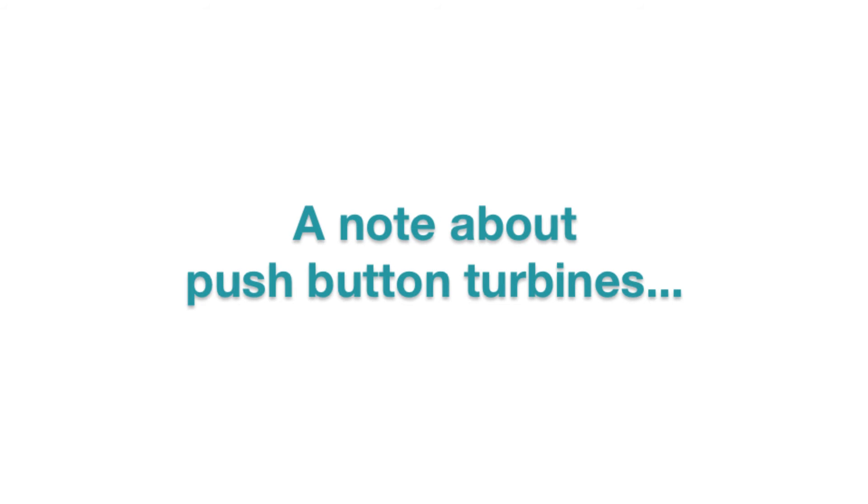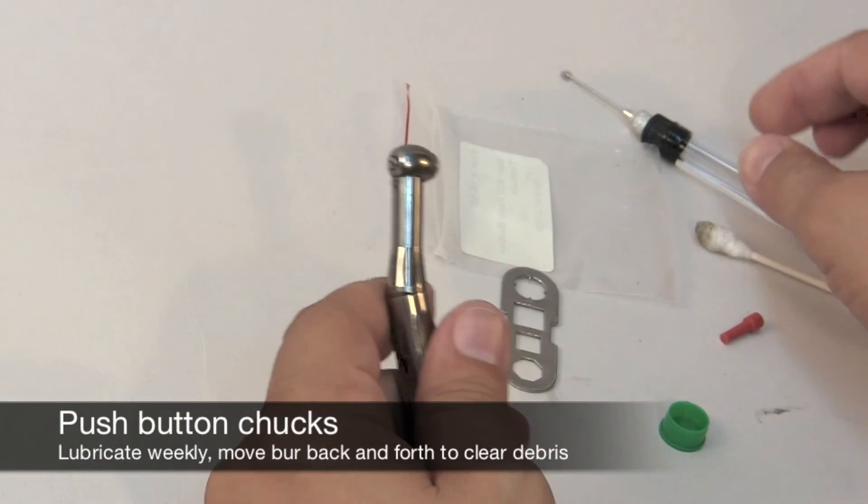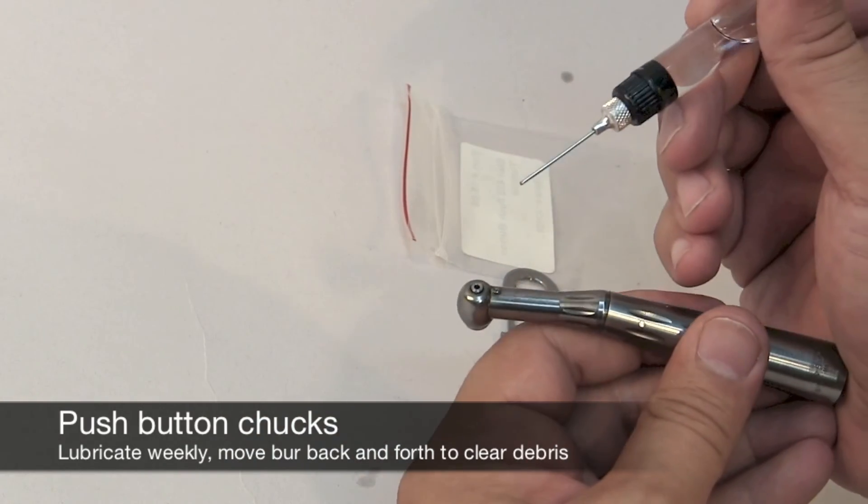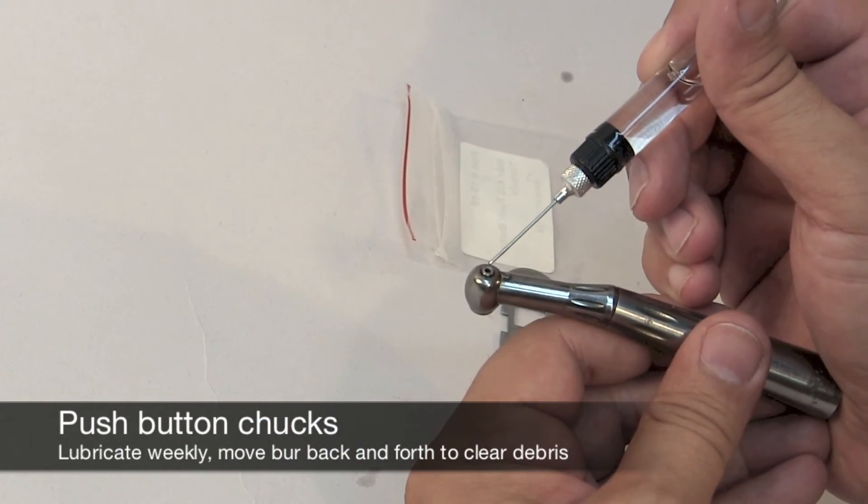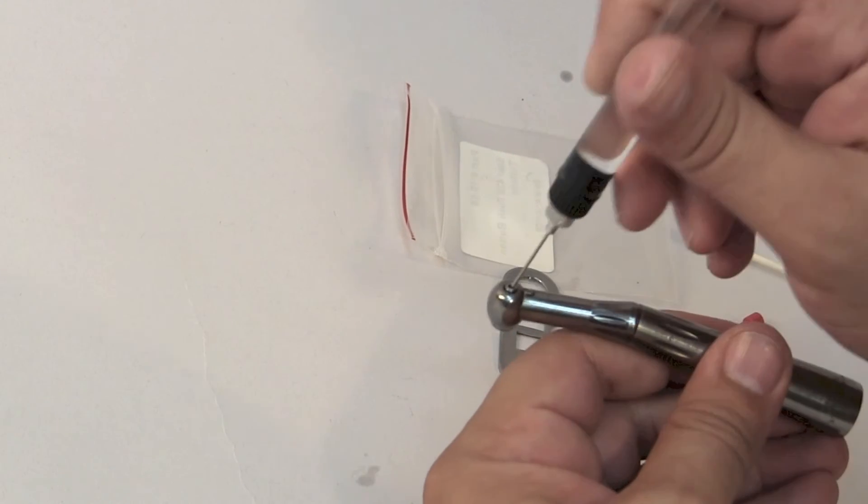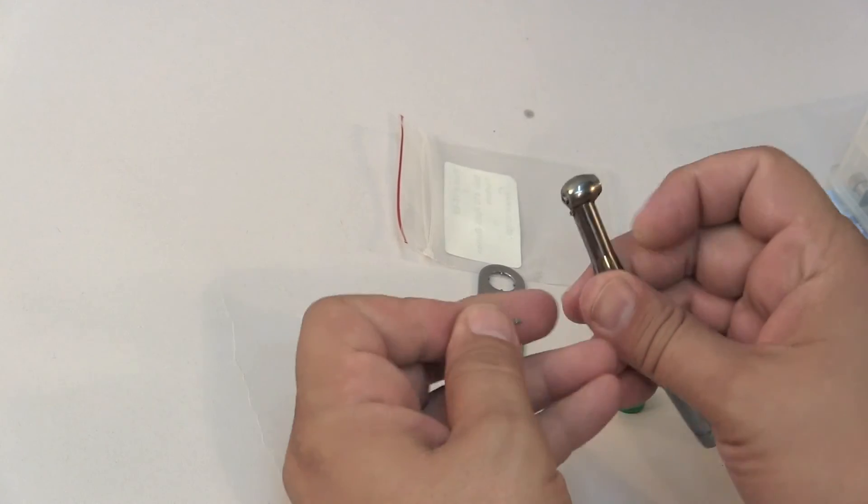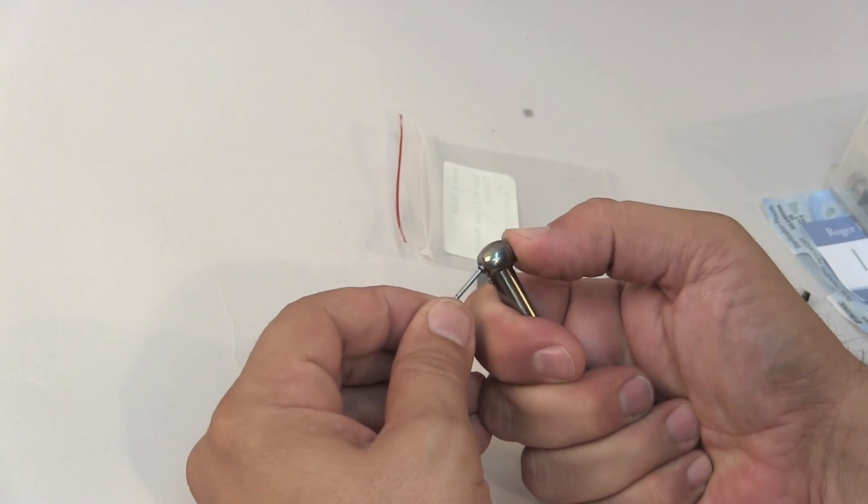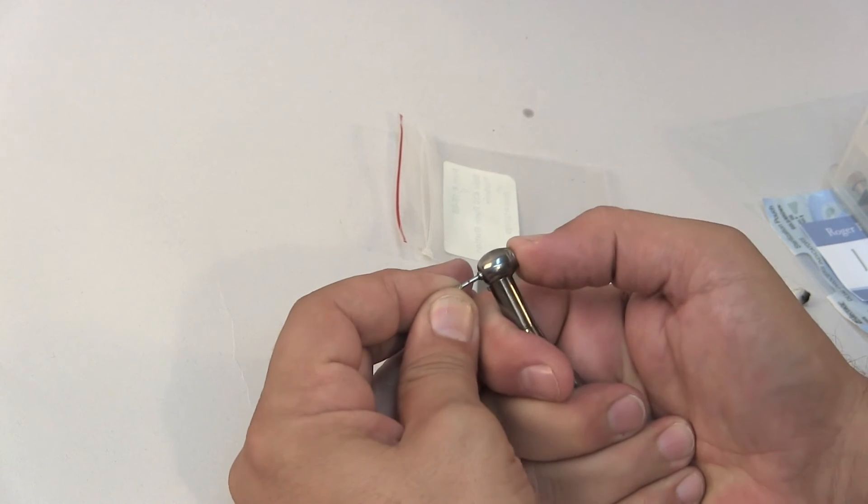A common complaint with push-button turbines is that sometimes the chuck will not hold the burr. This is often caused by debris in the chuck and not a chuck failure. We recommend weekly lubricating the chuck by placing a few drops of lubricant into the burr end of the turbine, and then inserting a burr and gently moving it back and forth with the chuck opened. This will flush the chuck and will usually correct the problem.